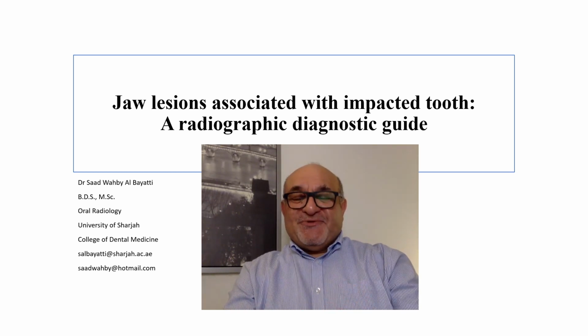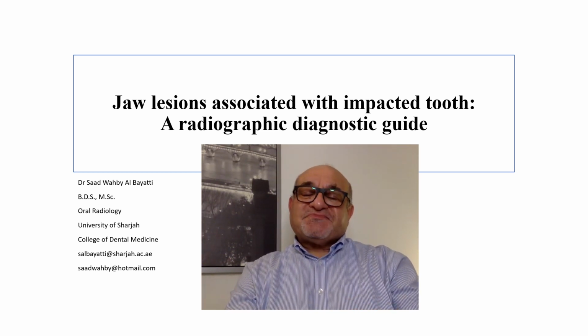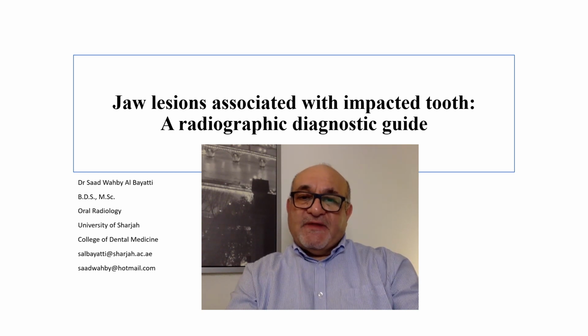Welcome everybody to a new presentation in the series of radiographic interpretation of lesions, whether they were radiolucent or radio-opaque. And in this presentation, we are going to discuss the jaw lesions which are associated with impacted tooth or teeth.